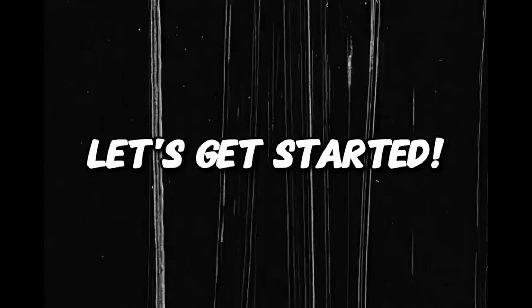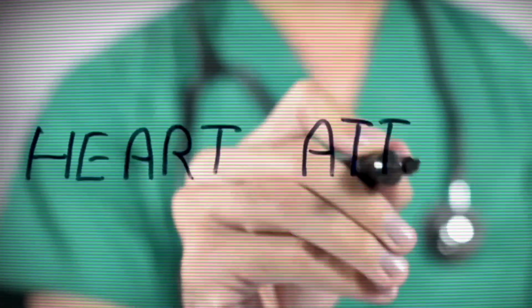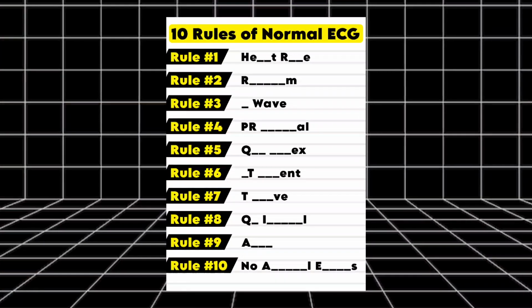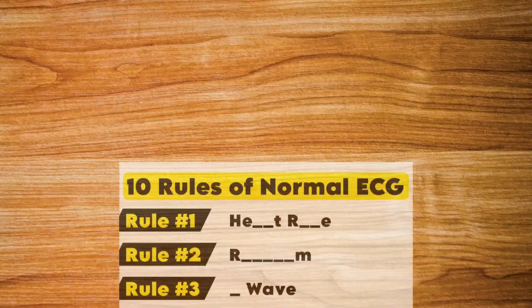Let's get started. The ECG is one of the most powerful tools in medicine, but here's the issue. Misreading it can lead to life-threatening mistakes. That's why today, we're going over the 10 key rules of a normal ECG. Follow these, and you'll never second-guess yourself again.